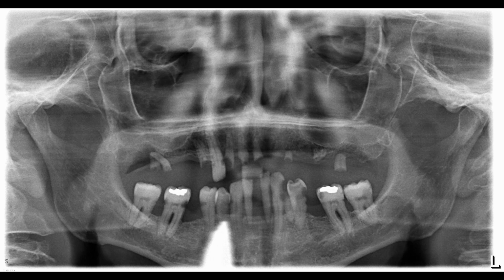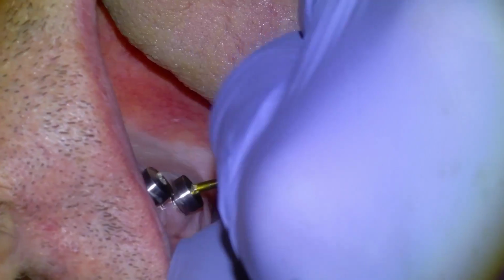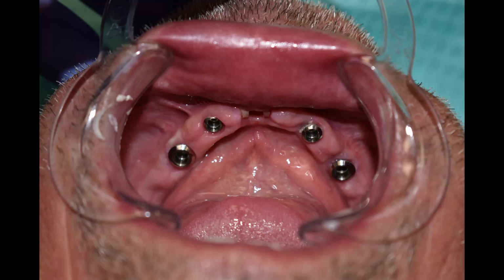You can see that all the upper teeth are pretty much broken off and infected, and all the lower ones have pretty severe gum disease, big cavities here and there, and all those lower teeth were loose. When you encounter a situation like this, there's nothing you can really do other than remove the teeth and plan to replace them with either dentures or implants. In this case, we decided to do a lower full implant bridge.